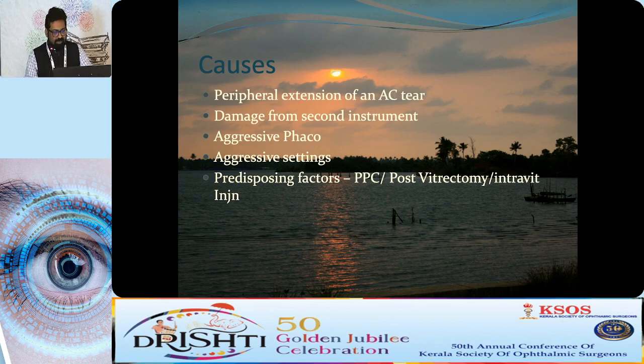Aggressive phacoemulsification. The settings, you overestimate the grade of the nucleus, and then you go ahead and you end up damaging the posterior capsule, and then subsequently nucleus drop. Aggressive phaco settings and predisposing factors.